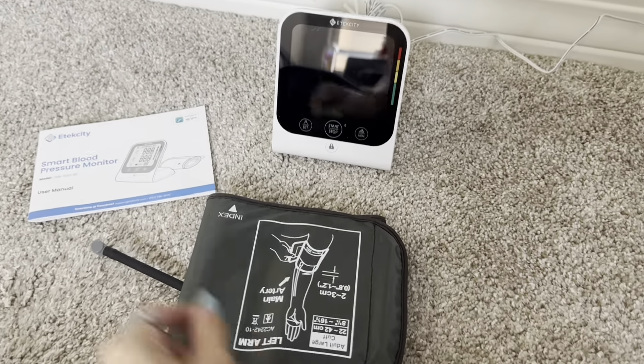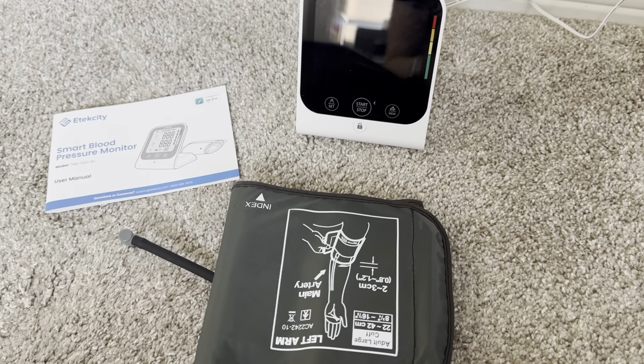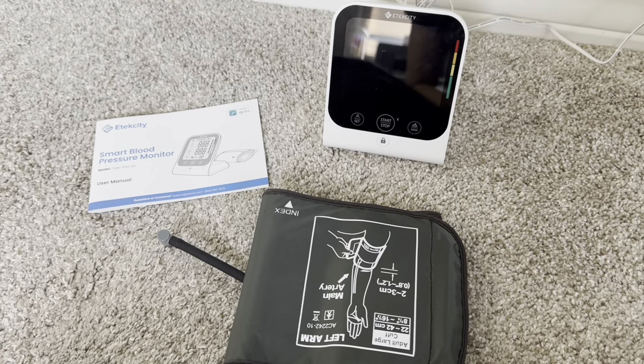And again, I love that it has the app integration so I can actually get the blood pressure downloaded onto an application on my phone and I can simply send that information to my doctor. I can trend it with other metrics to really keep an eye on my health.